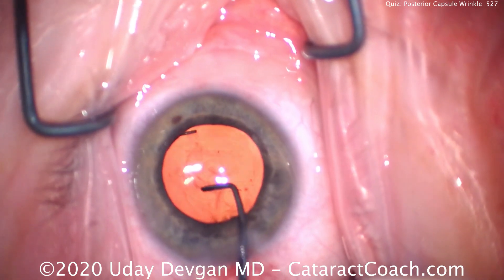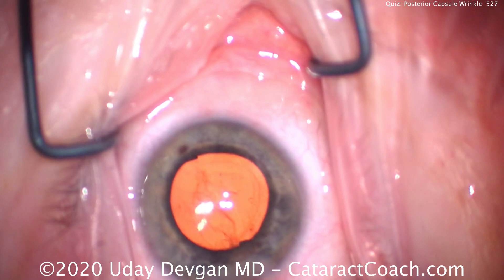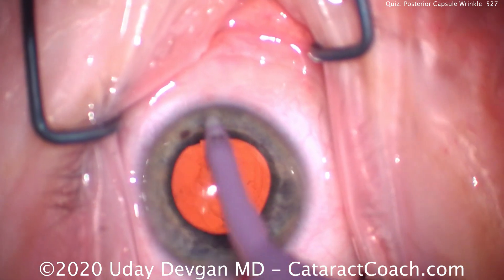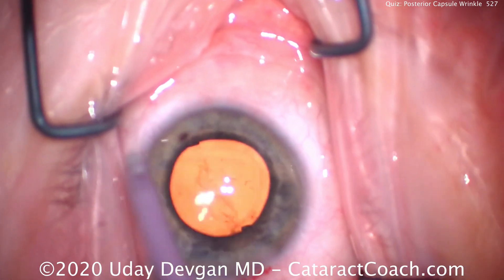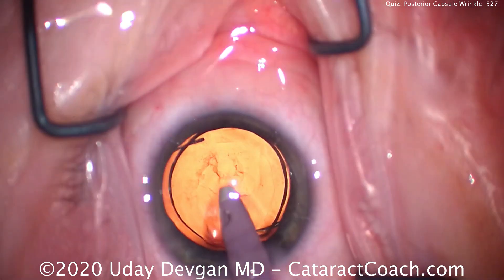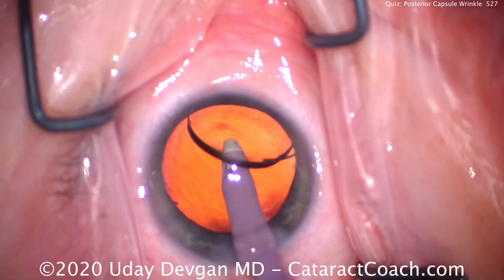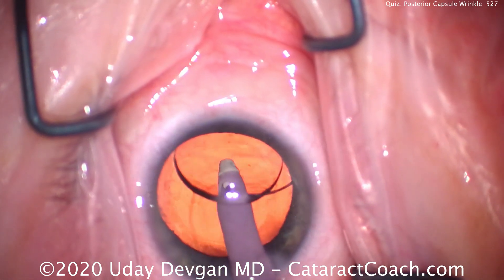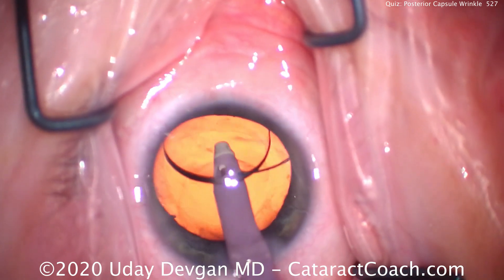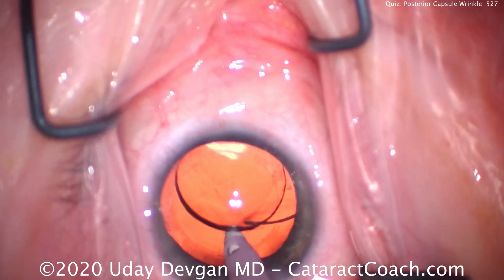Delivering that second haptic in the capsular bag. It's beautifully centered. Nice overlap of the capsular rexis. Looks pretty good — there are no wrinkles now. Let's put in the IA probe and remove the viscoelastic. We'll go under the IOL and remove all of that from the posterior surface of the IOL. Make sure the capsular bag is completely free of viscoelastic — take out all the OVD.